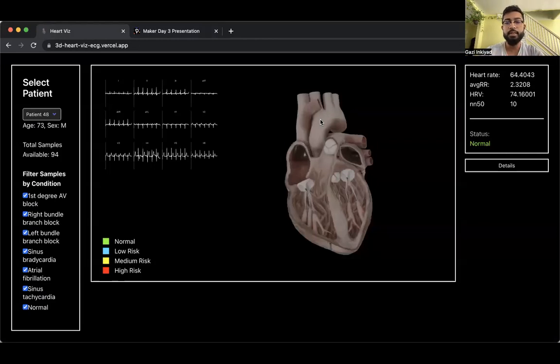Okay, so this is our web app that I mentioned earlier. We have about hundreds of patients of data. And the machine learning model that we have here is looking into different arrhythmias. We had this model from a Nature article that we'll be happy to share. Honestly, since we didn't have a lot of time, we wanted to have something for our Maker Day, to have the MVP product. This was a great way to start because the model was well established.